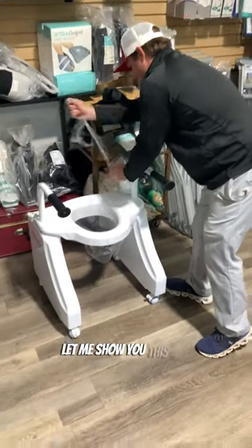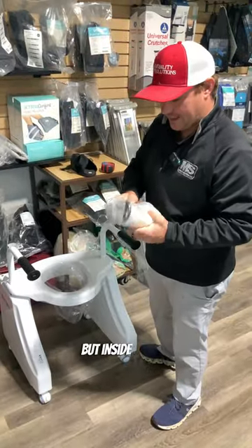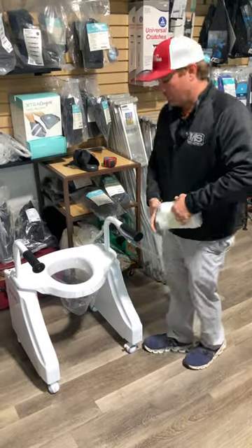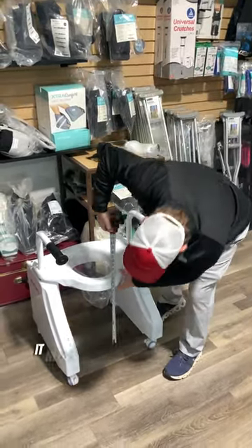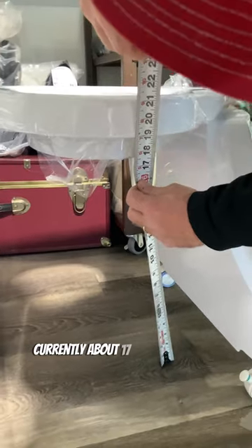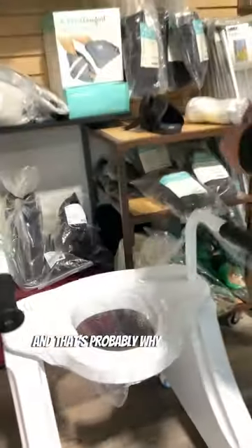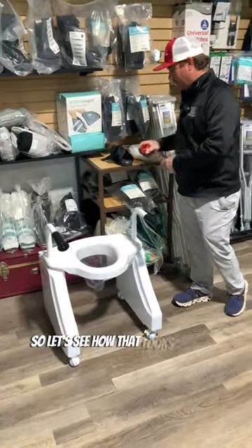Let me show you this too. There are two sets that come with both. Inside of here you should have feet that you can adjust, level it, or make it higher. Currently with the caster wheels, it needs about 17 inches to this lip to go over the toilet — and that's probably why you'd use this if you want it higher.